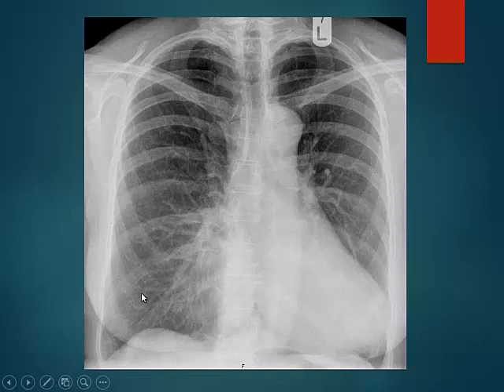Yeah. So this is pectus deformity. So the features of pectus deformity on chest X-ray are vertically oriented ribs, heart displaced to the left side, indistinct right cardiac border. Okay. This is pectus. And to prove this, you do a lateral chest X-ray, or you see the patient, you will see the pectus deformity.